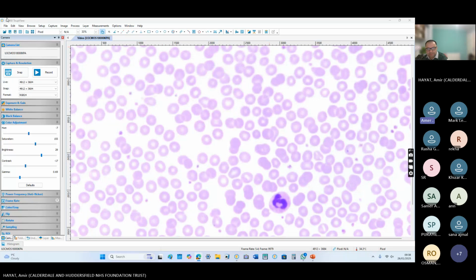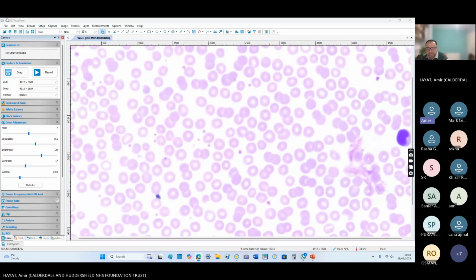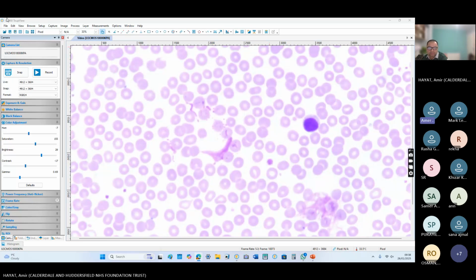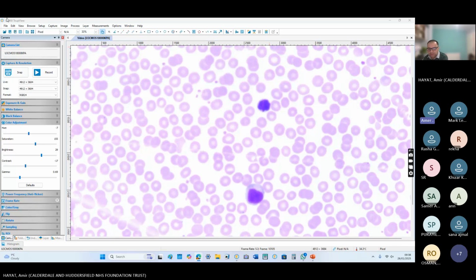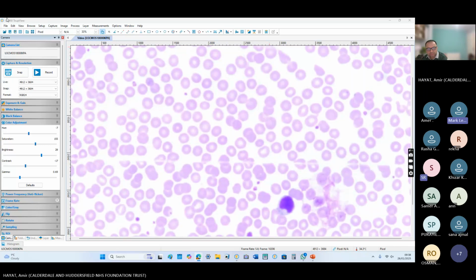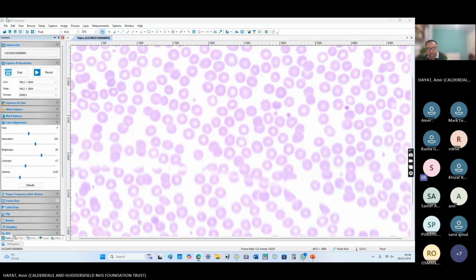Right, so the lab scientist thinks that this is lymphoma because the patient has lymphadenopathy. He has read the history on the request form, and now he has referred the blood film to you. Clinical hematologist, report this blood film. This is a very common exam question. RBCs are normocytic, normochromic, and the platelet count is quite normal, adequate.